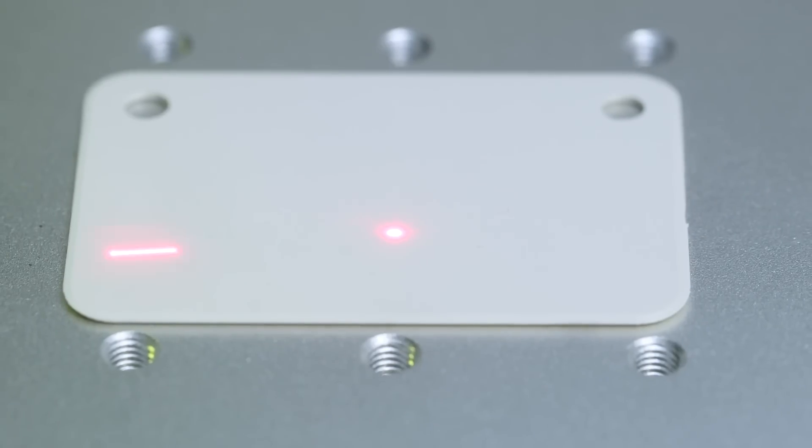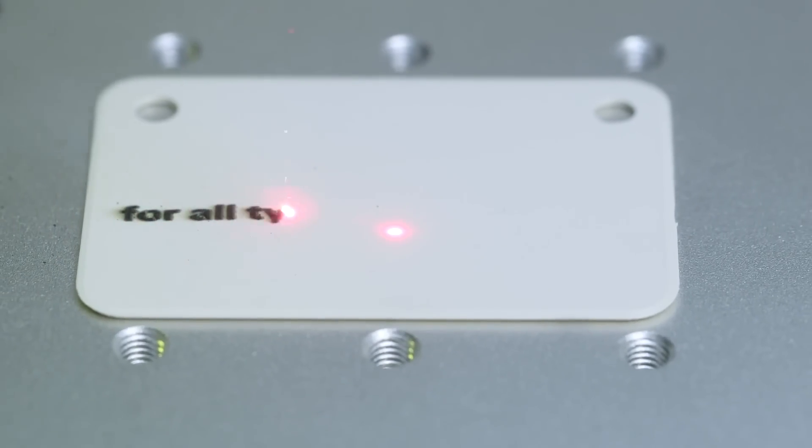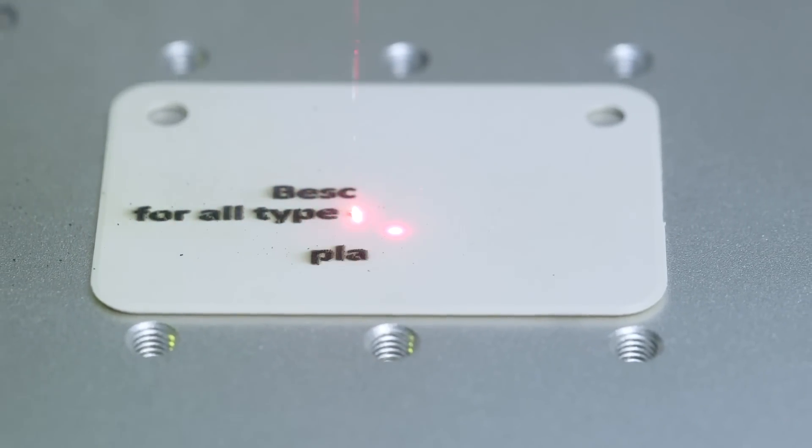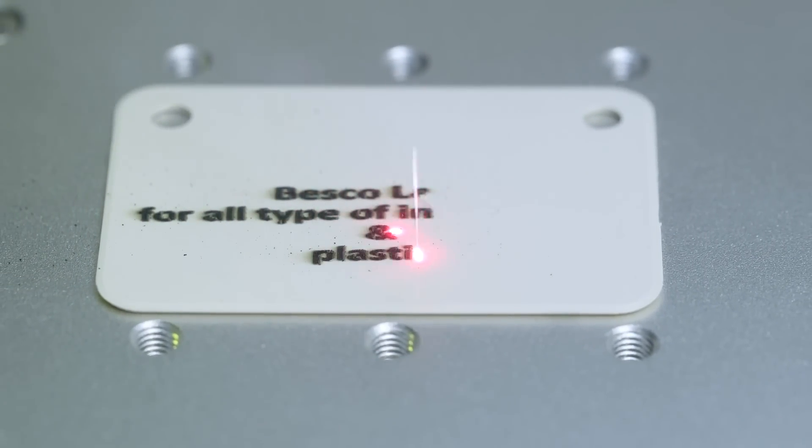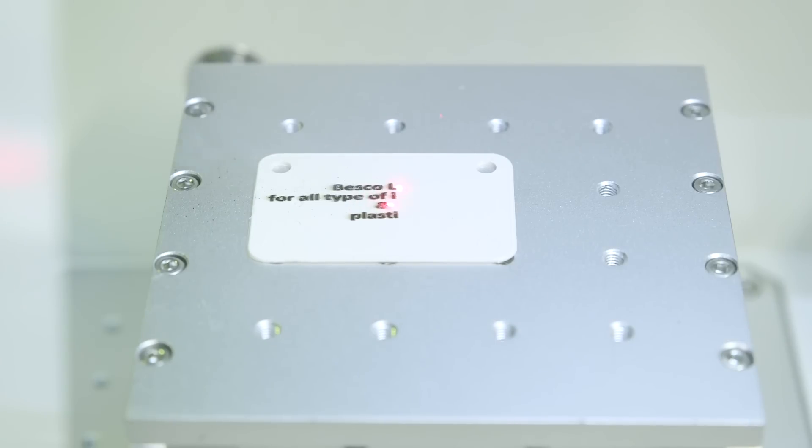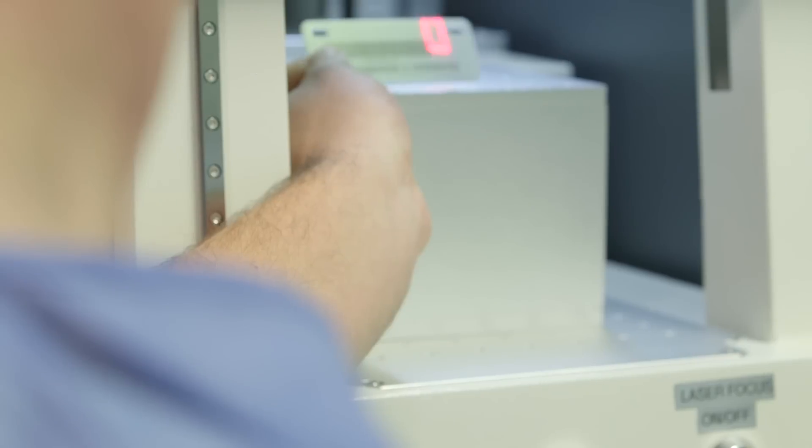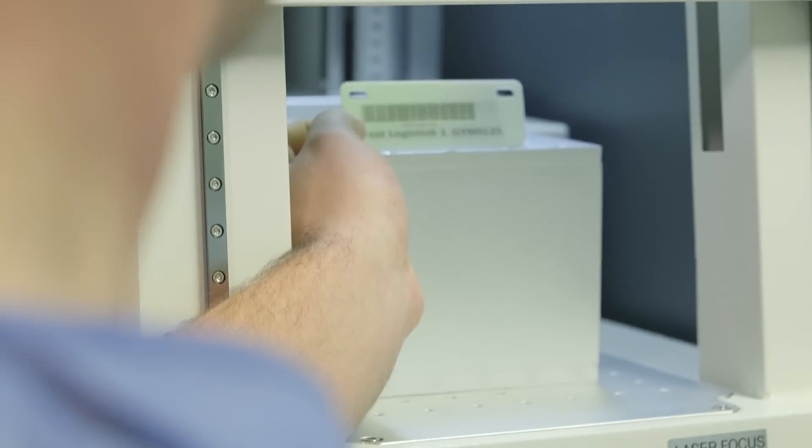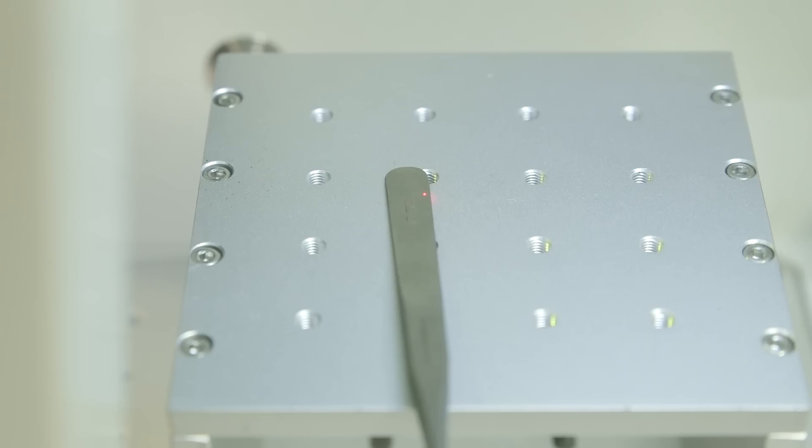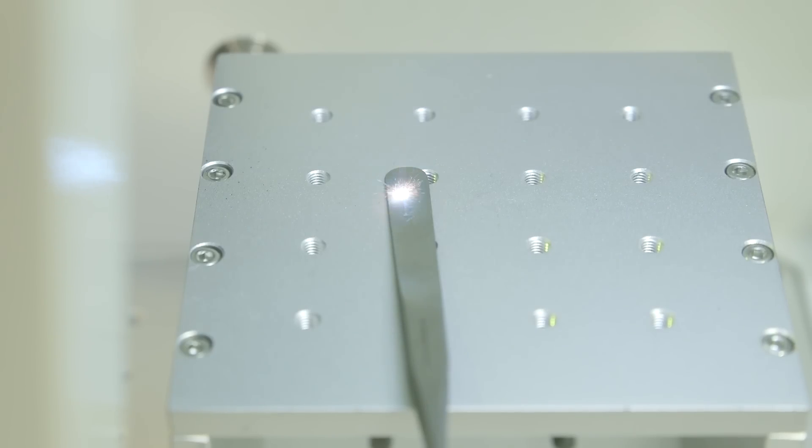The Besco Laser for perfect, durable data matrix marks on titanium, anodized titanium, aluminum, stainless steel, plastics and more surgical instruments. We mark light speed on your surgical instruments.